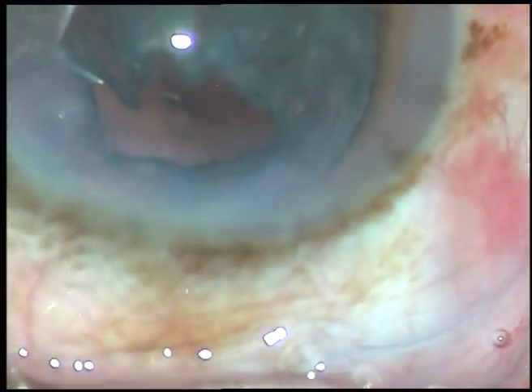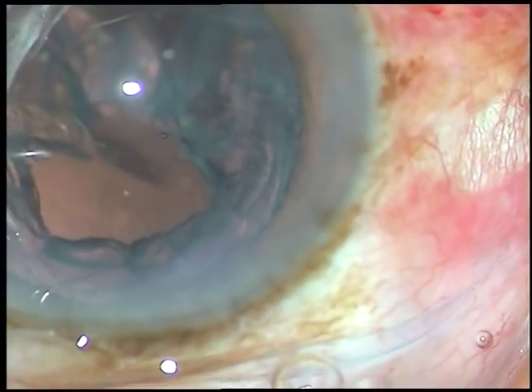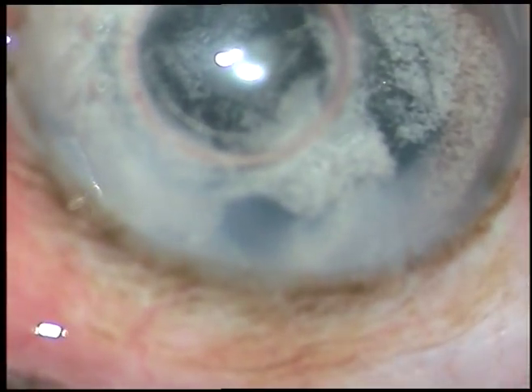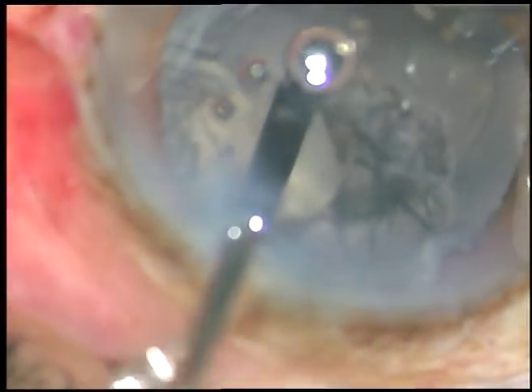Dear colleagues, PC rent has occurred in this case. The surgery was being done by one of my fellows. Now I have taken up this case for managing the PC rent. A big chunk of nucleus has dropped into the vitreous cavity.